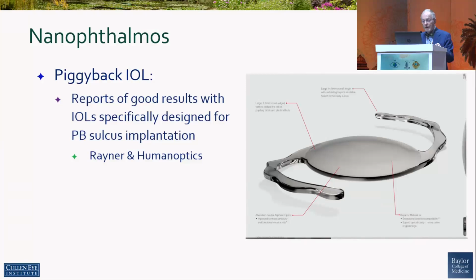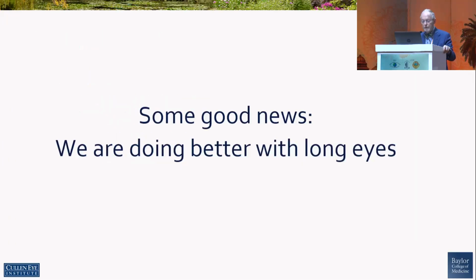And piggyback IOLs, I actually learned this from colleagues here in India. You have access to these wonderful add-on lenses. This is the one time in a short eye one could probably use a piggyback IOL, but I'd like to hear people's experience with that.